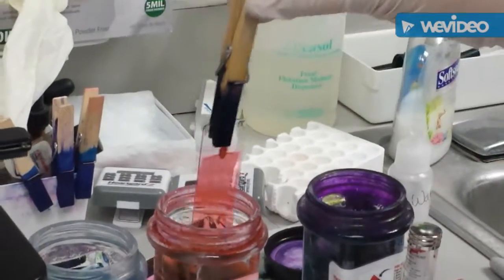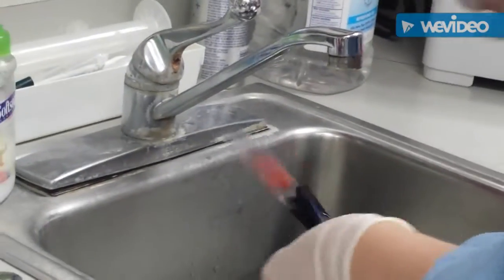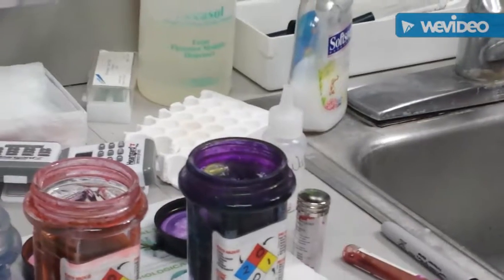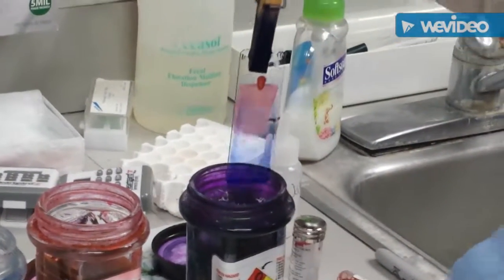So that feathered edge is going to space them out for us. The things that you can read in there are your white blood cells, your red blood cells, your platelets. So we're going to put this in our final stain, and we're going to do 10 1-second dips here as well.